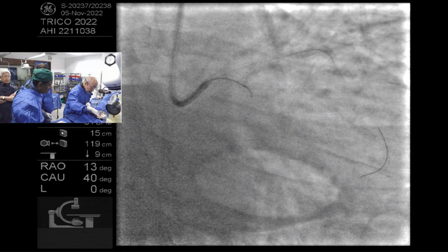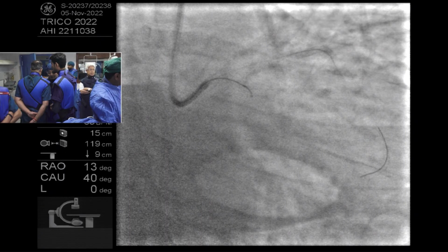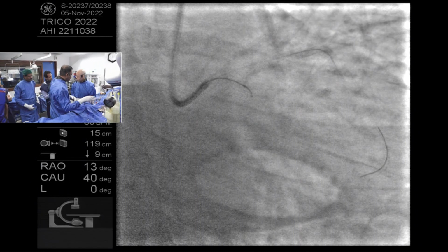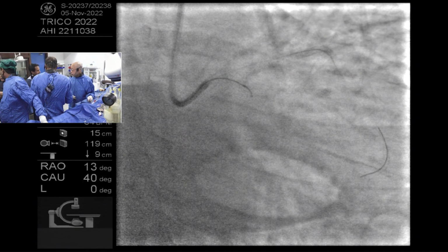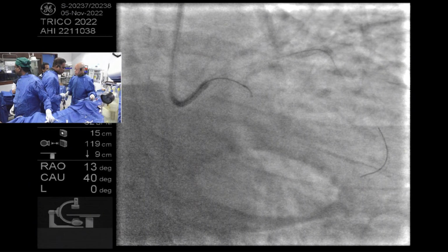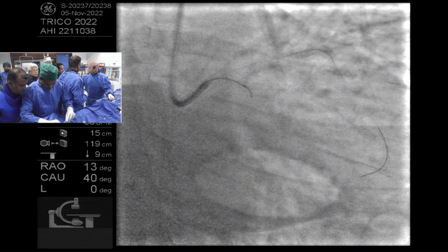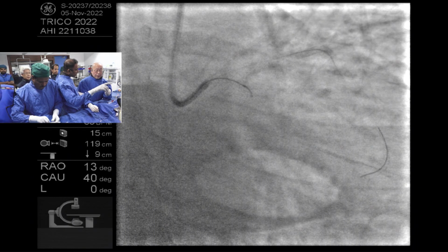Either that or a microcatheter with a curved tip, which will let you engage the ostium. Could, yeah. But you think with an export catheter you can use the side hole, or you make a hole? Export catheter, thrombus aspiration, you have the side hole. It's like a dual lumen catheter. Instead of aspirating thrombus, you put your wire through the side hole. We can cross the wire.